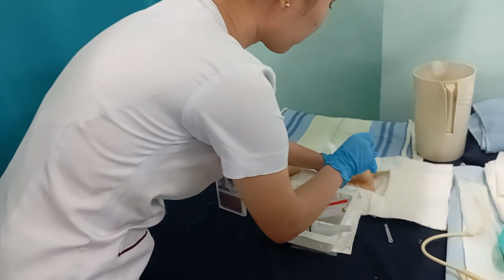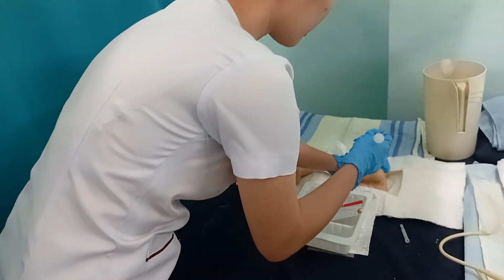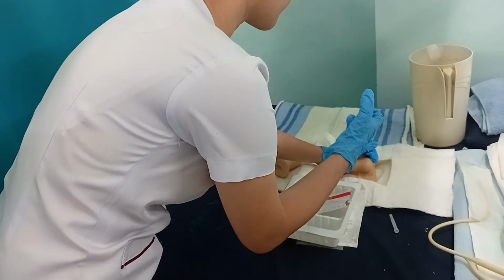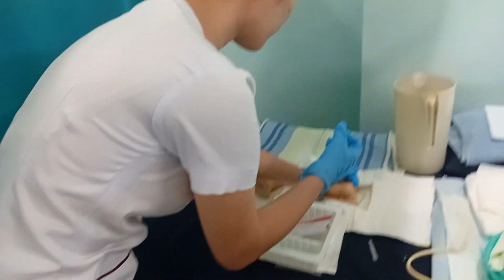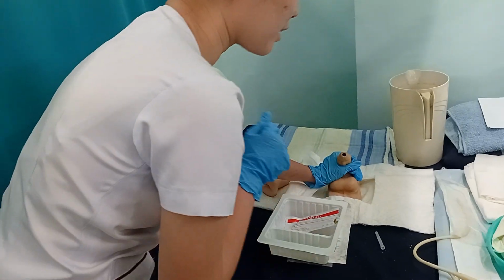We're going to inject the lubricant. What do you call that lubricant in that syringe? The lube syringe. Okay, inject the lube syringe. And after that, we are going to proceed with the insertion.